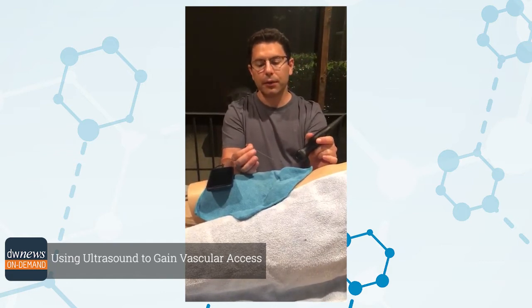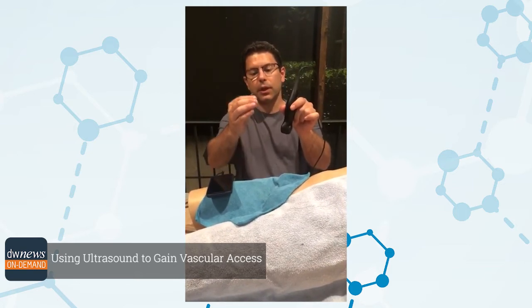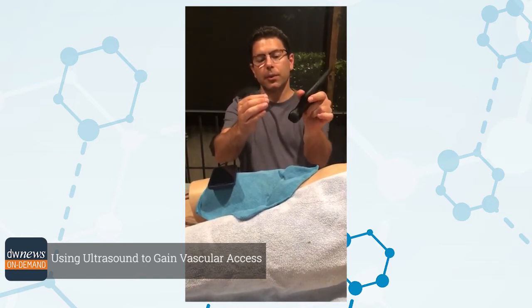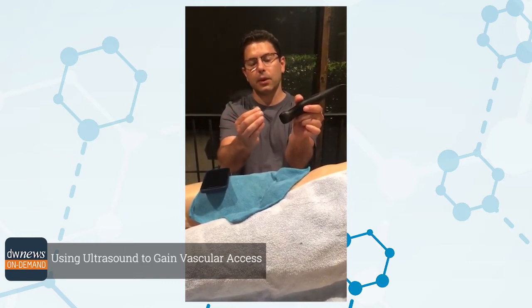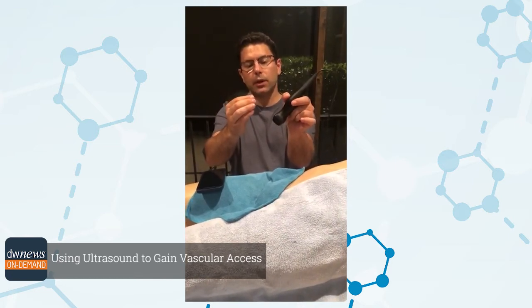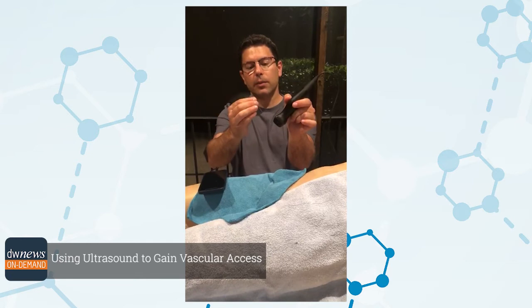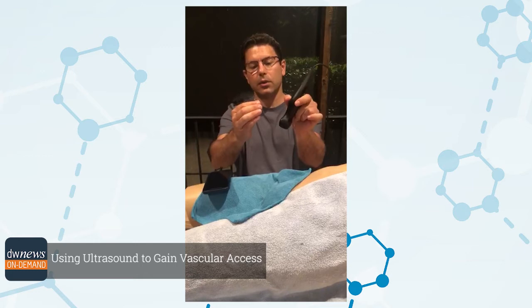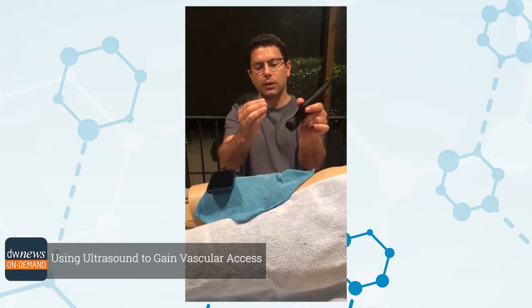Often enough we see a lot of mistakes with people placing the ultrasound probe right there and trying to come down with the needle without being able to see the needle. Other people incline the ultrasound probe too much to a point where it actually passes the ultrasound. You're going to have to picture a 3D image where you're ultrasounding the tip of the needle. One little detail that may help a lot is on your way in you can jiggle the needle back and forth to be able to see it and readjust the angle of your left hand or right hand, depending on how you're getting access, in order to see the needle tip.